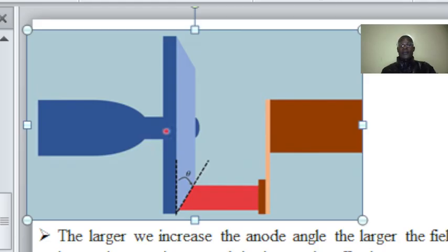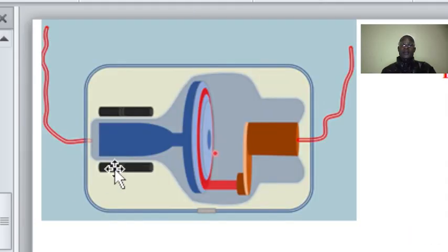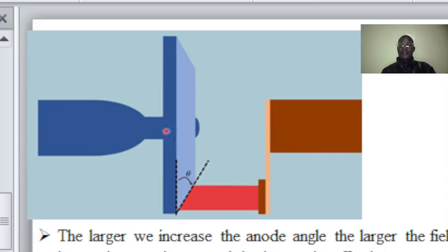But also a pool of oil is used to conduct heat there. And 10% rhenium is always added to the anode track, to the focal track, to sustain the integrity and prevent the tungsten from cracking. And the heat can also be controlled by short exposure.